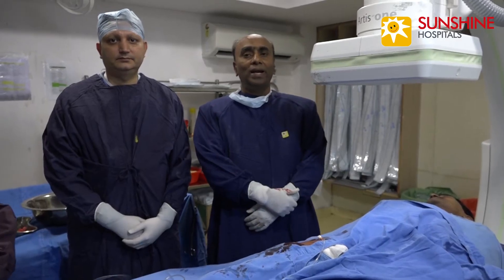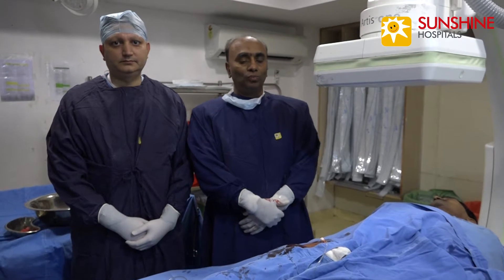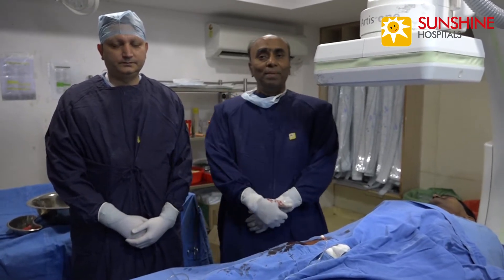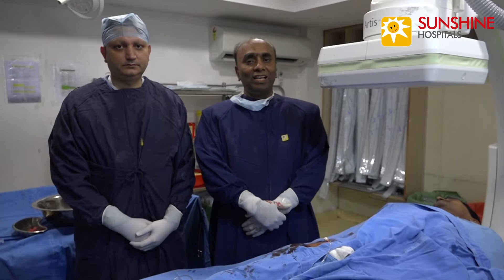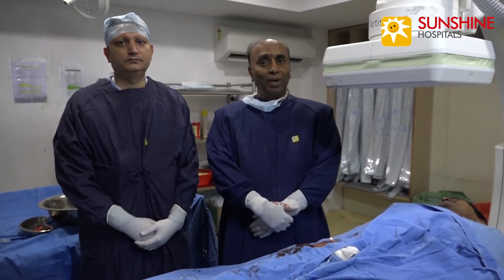I am Dr. Vijay Kumar and Dr. Sanjeev Kumar. Today, we are showing imaging that is intravascular ultrasound or IVUS of the left main.